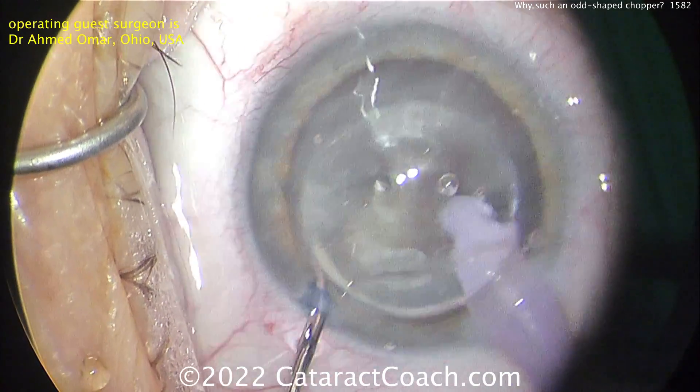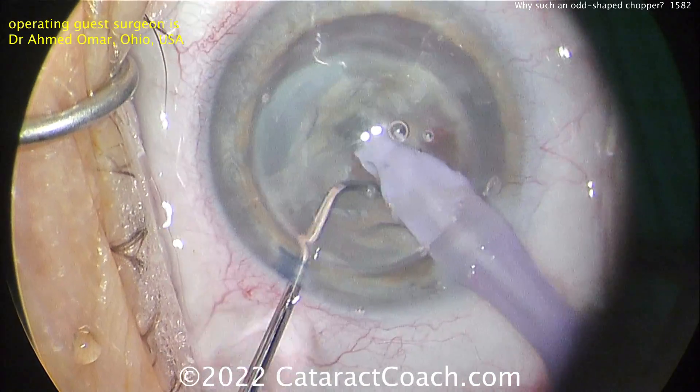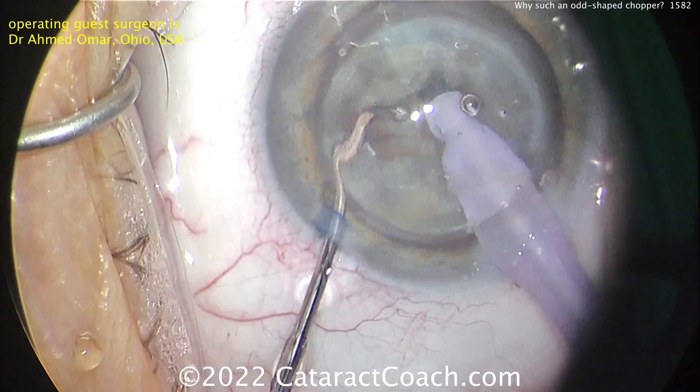So the surgeon is going to do a nice job here removing the nucleus and taking his time. Obviously a very talented, very experienced surgeon.